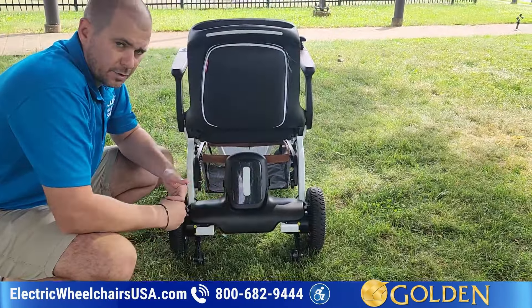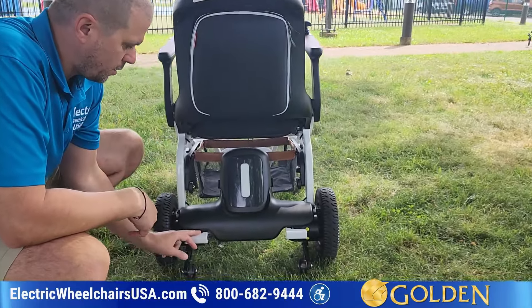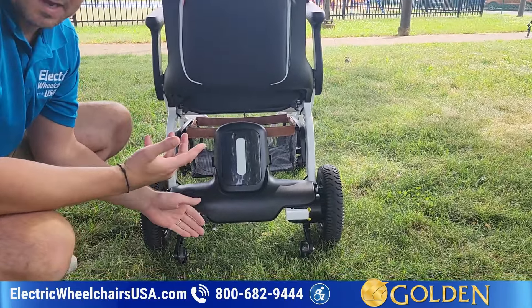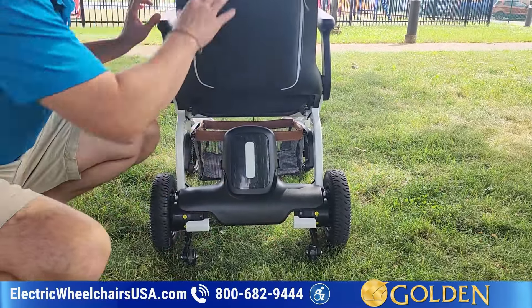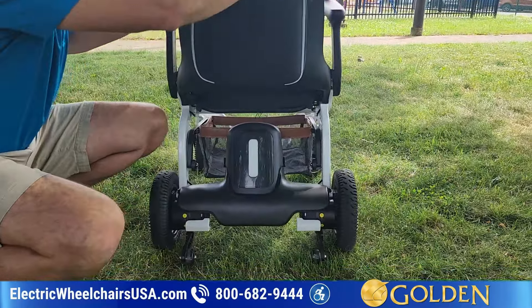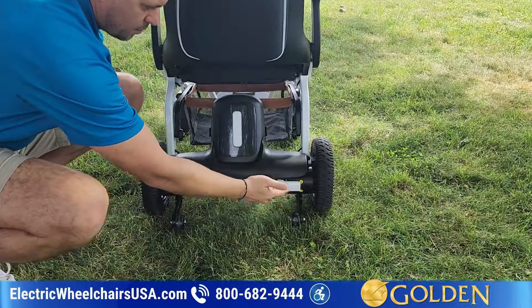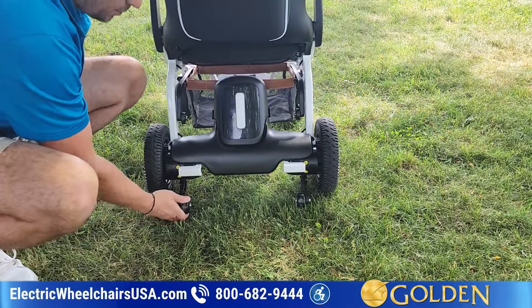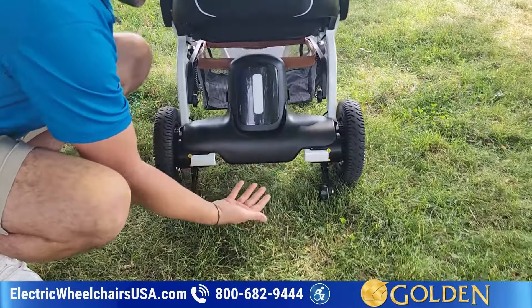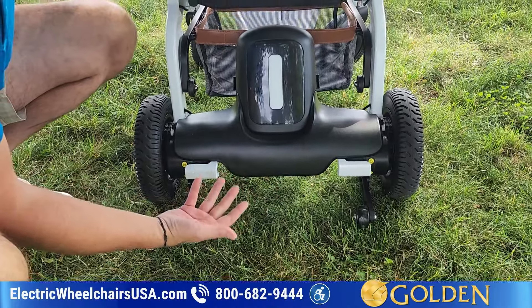On the back of the Ally, a couple of things to note. These are your freewheel buttons. If you happen to run out of battery, you can press both of these down — it puts it in freewheel so you can push it like a manual wheelchair. It has a handlebar here. In order to operate the chair, you have to press both of these back up into the lock position so that it's engaged. These are anti-tip wheels, there for added safety to prevent you from tipping backwards if you're going up an incline.